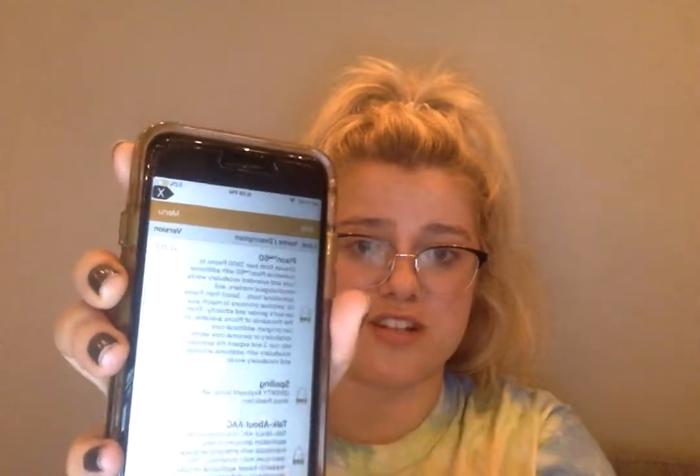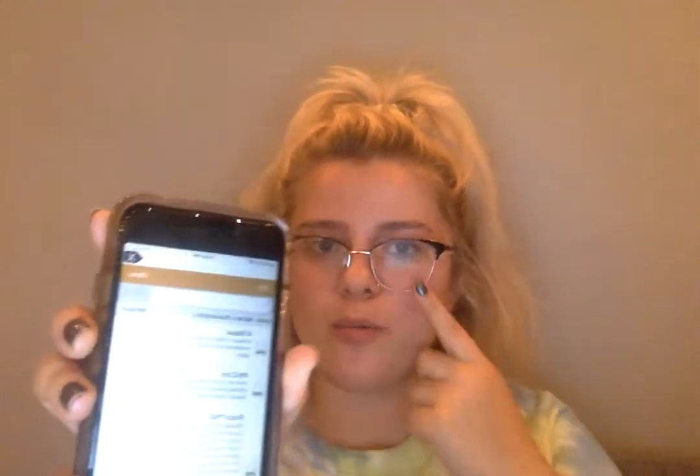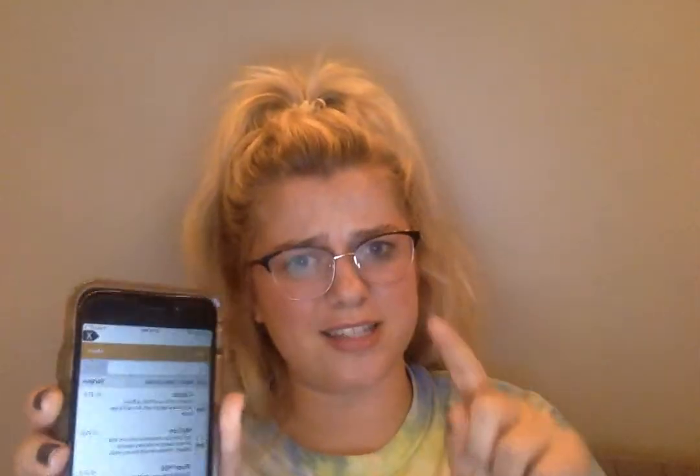There are a lot of variations within this device, which is pretty cool. This is the vocab page where you can choose the different types of keyboards. And it also has the ability to lock it on a specific keyboard so kids can't go through and change it on accident. It'll be the same for them every time they open it.